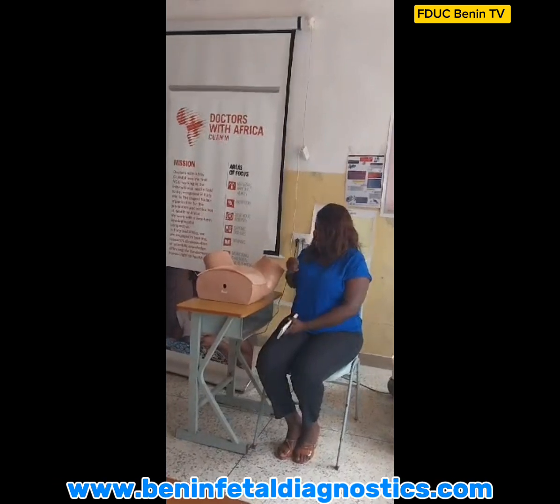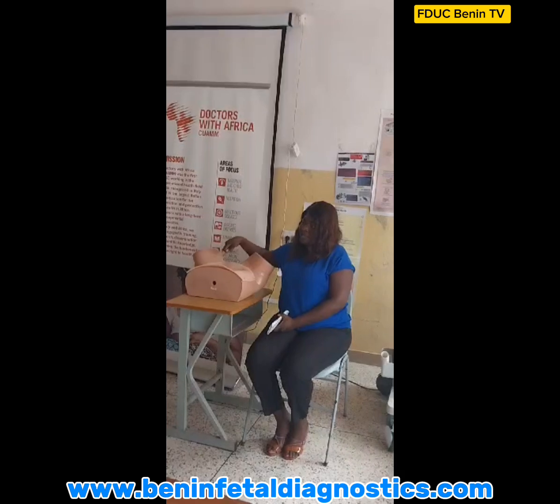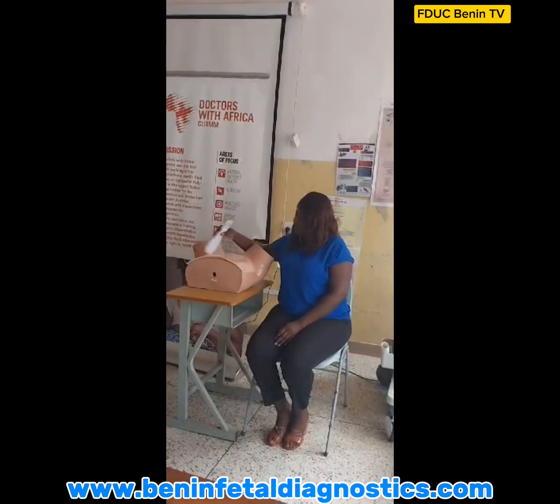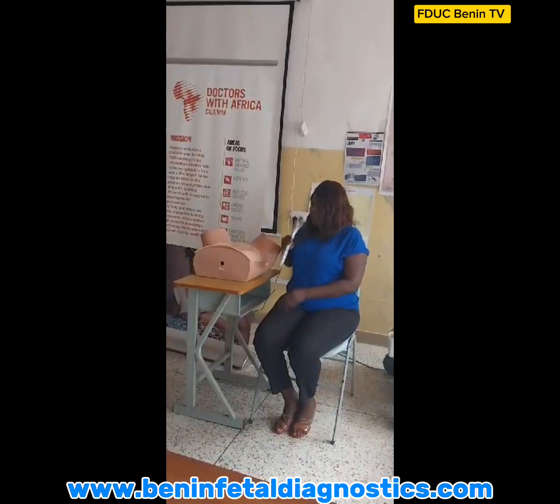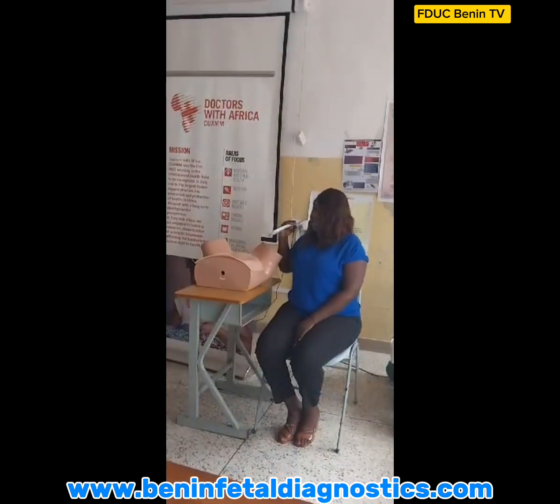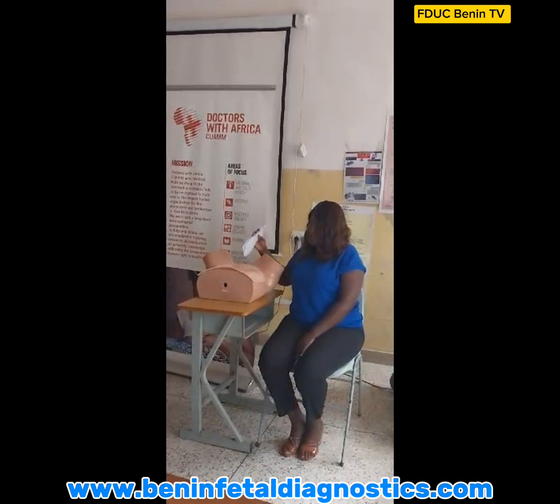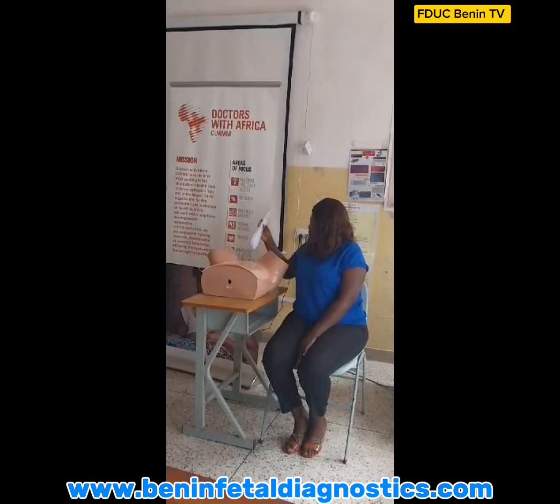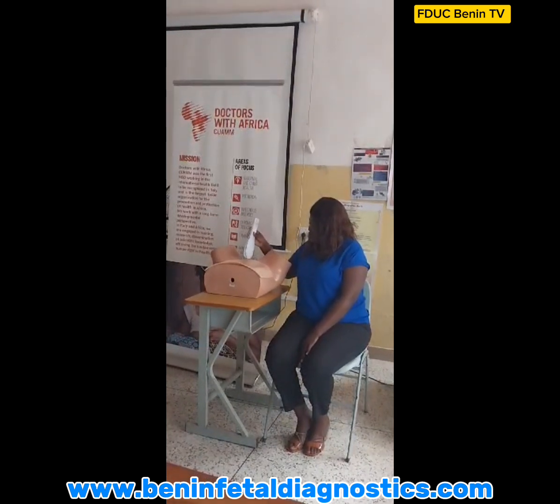Then I'll apply my gel in the midline on the left and right lateral abdominal wall. Then I'll smear evenly on the anterior abdominal wall. After that, I'll pick my probe and make sure that the orientation marker is facing the maternal face. Then I'll identify the pubic symphysis and place the orientation marker above the pubic symphysis.